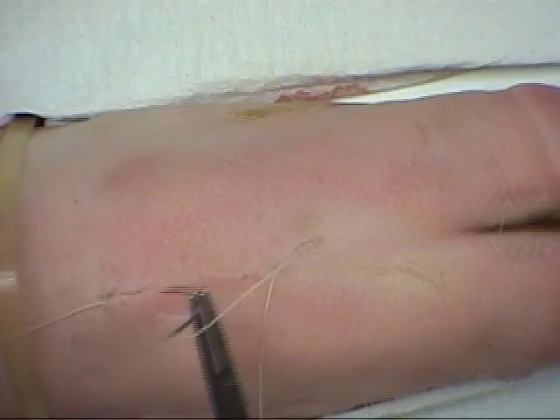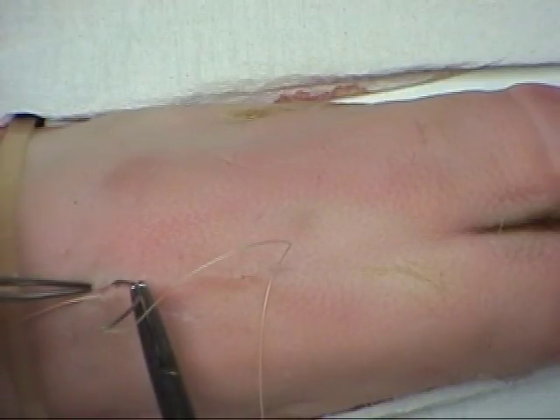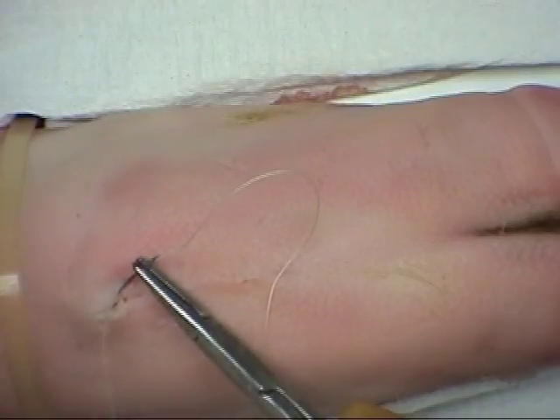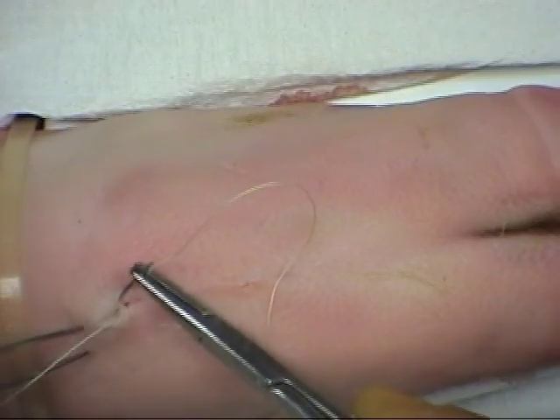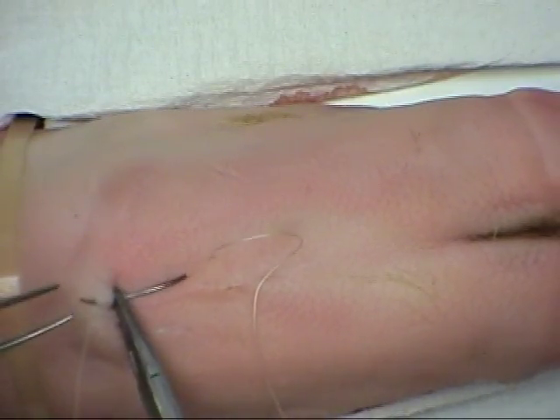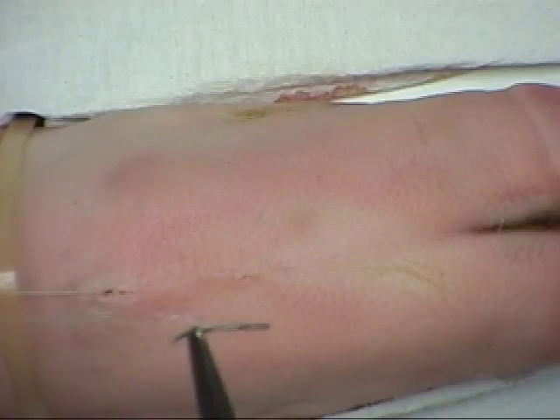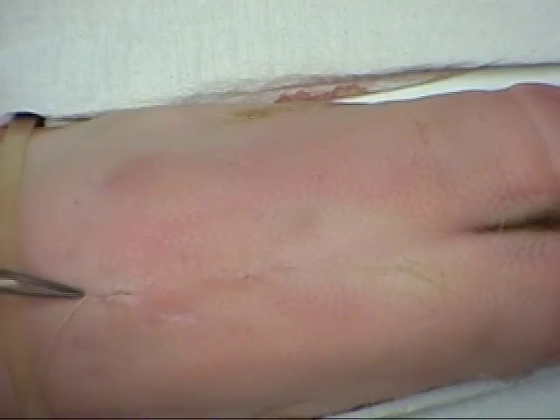Once the other end of the wound is reached, the sutures will be quite superficial and it will not be possible to place a deep knot. A superficial knot at this point will erode through the skin surface and produce a small stitch abscess, reducing overall cosmesis.